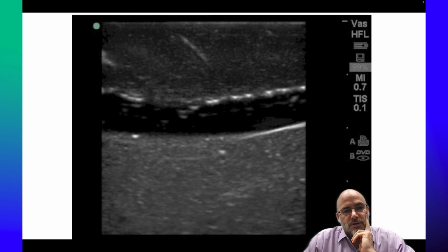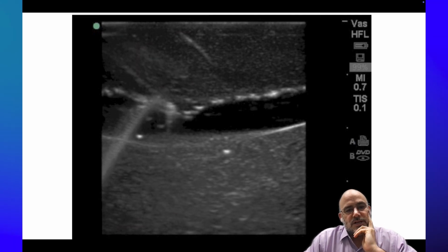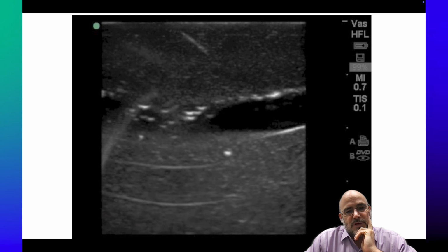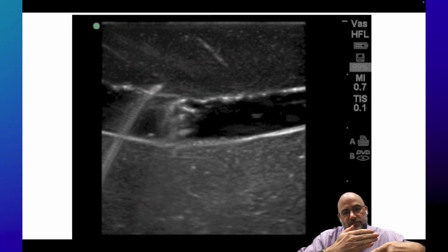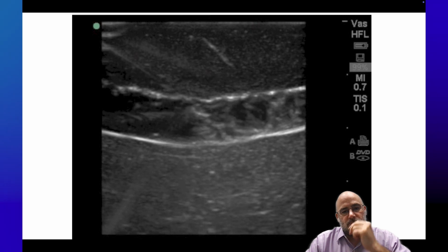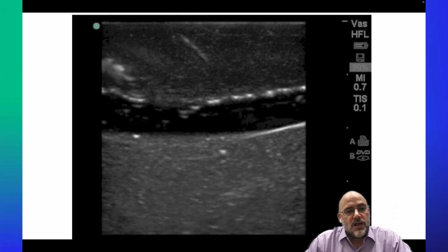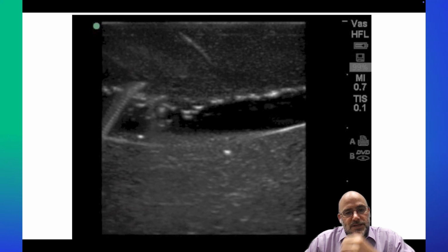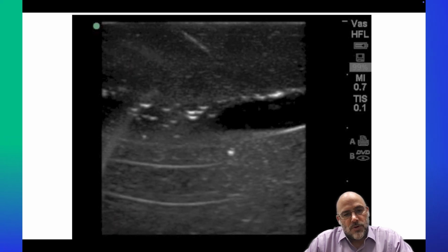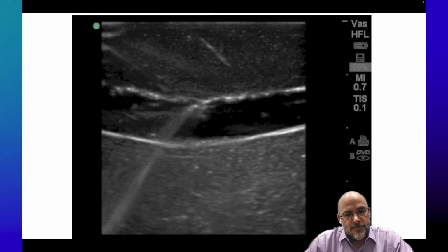So here's what that would look like. Your vessel is there in long axis, that tube, and you're seeing your needle tip and the needle shaft come in from the side of the screen in long axis. You're a little bit out of plane, a little right-left here, but you're basically seeing the tip, which is what you care about, and the shaft coming into view. And then you're actually seeing here in this model them putting some flow into the model.